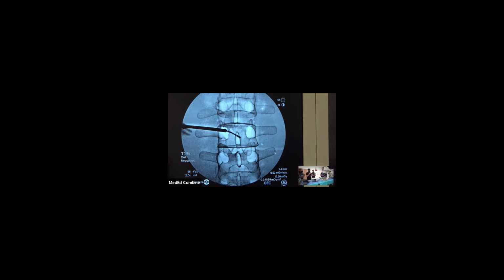So at this point, we would take out the curved cannula. Flick blood all over everybody, around the room. And this is the straight stylet. What do we use this for? This is for if we haven't made it all the way medial. This happens a lot at L5 and S1. They're wider vertebral bodies, or you have a big guy, a muscular guy. They do have wider vertebral bodies than little old ladies. So this helps you get across further medial when you run out of room with the curved cutting knife.